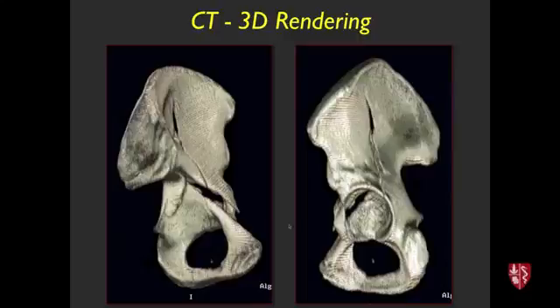It's also useful for patients. You can intuitively see something like this much easier than you could see the cross-sectional scans.